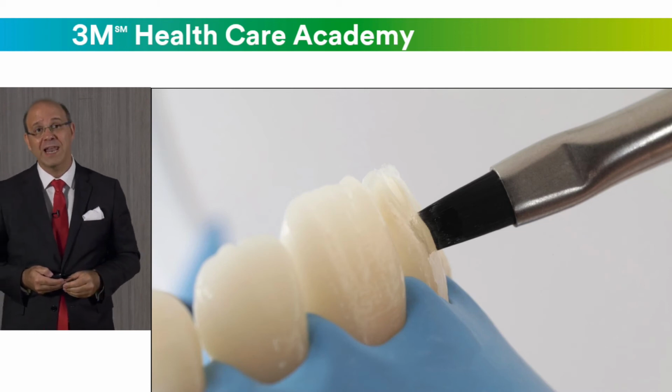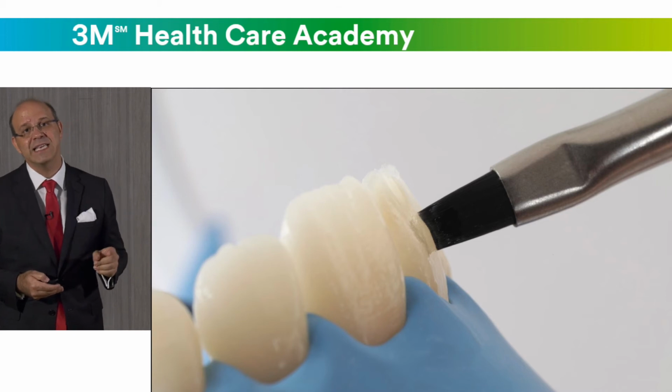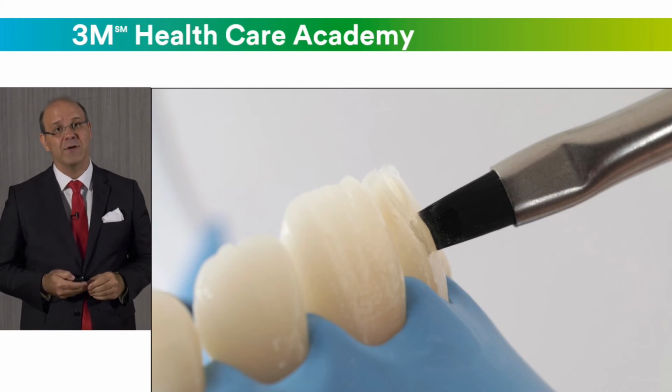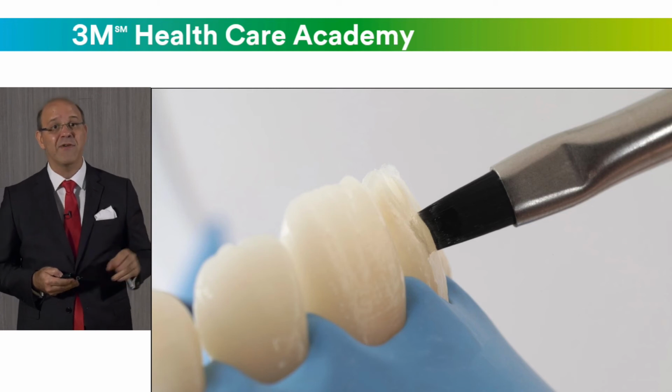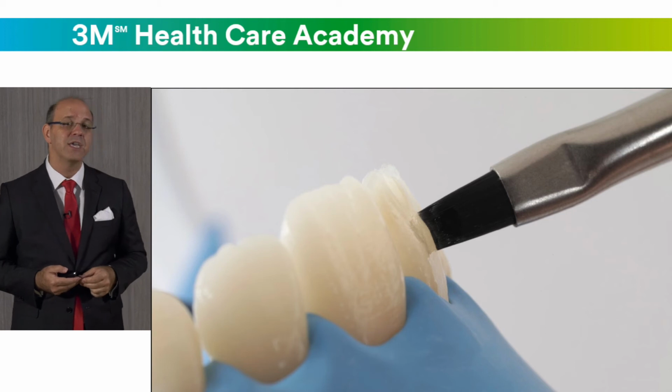But before we light cure, we have to take care with this step. This is the way you blend, you put the enamel to the bevel. So the tip is, to have a very smooth surface connection between the dentin and the bevel, use a brush.